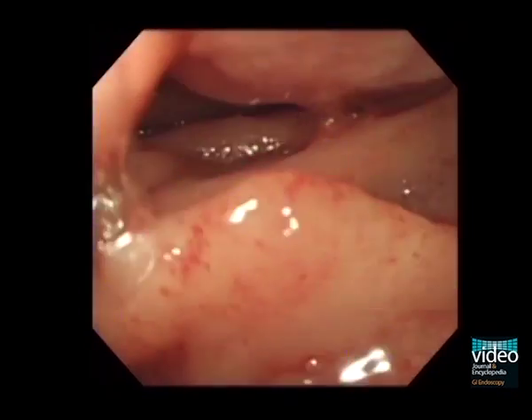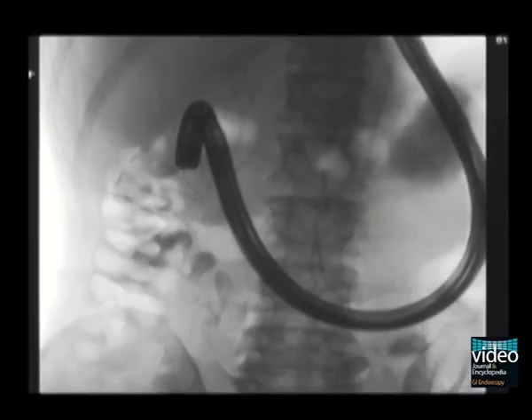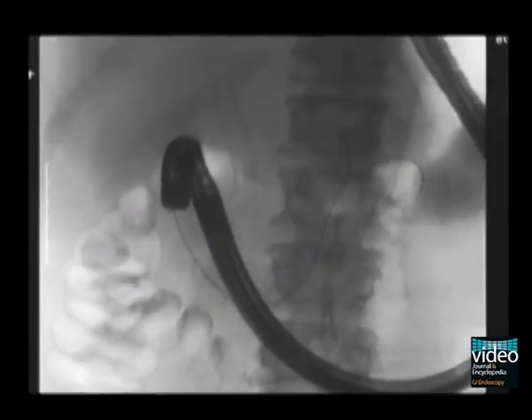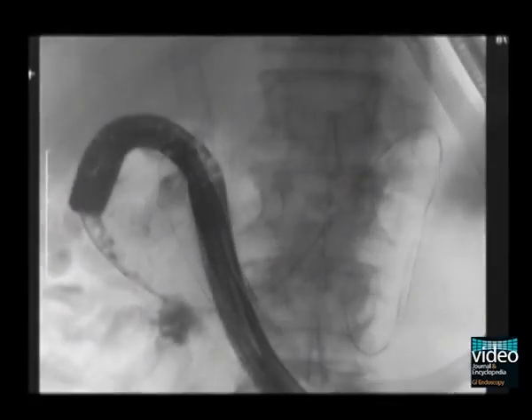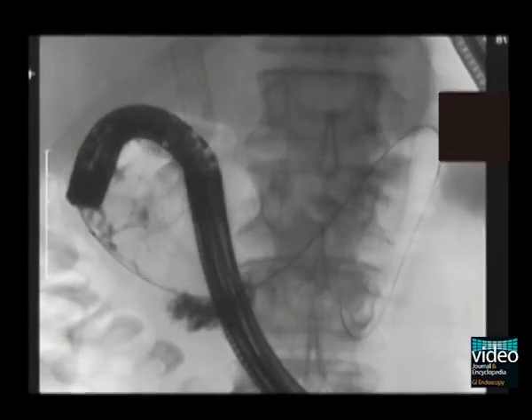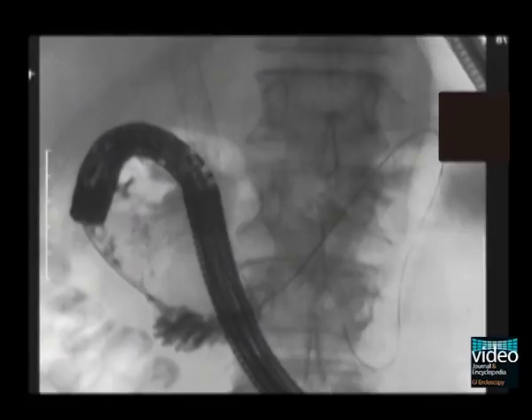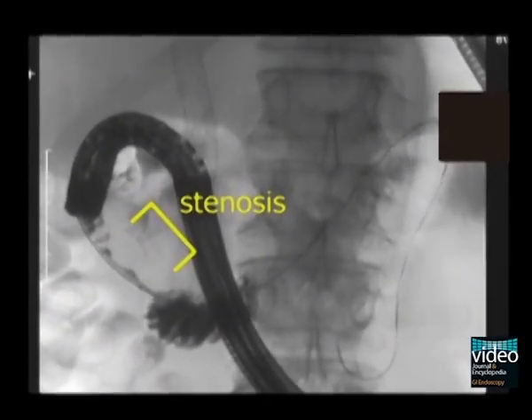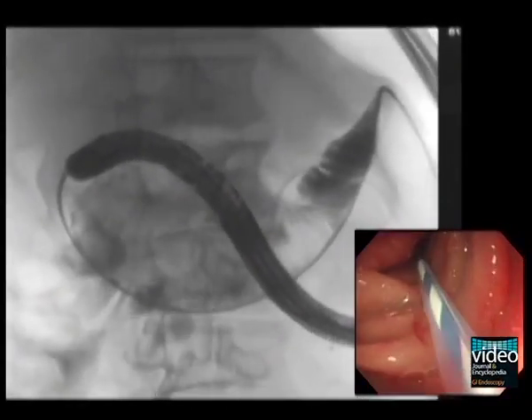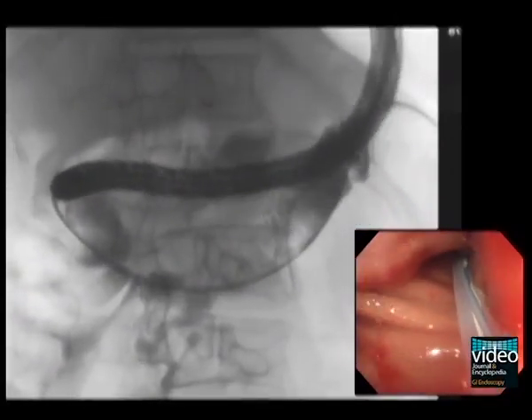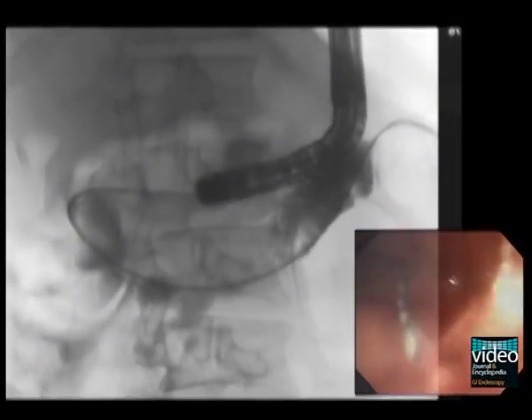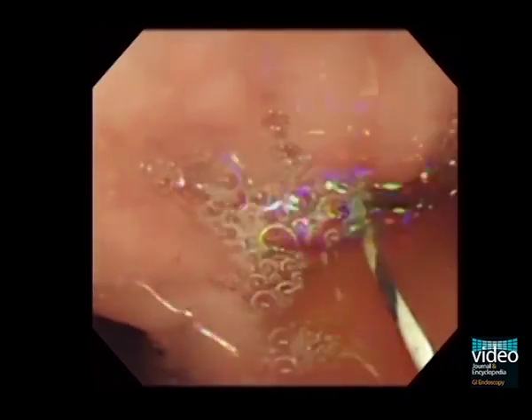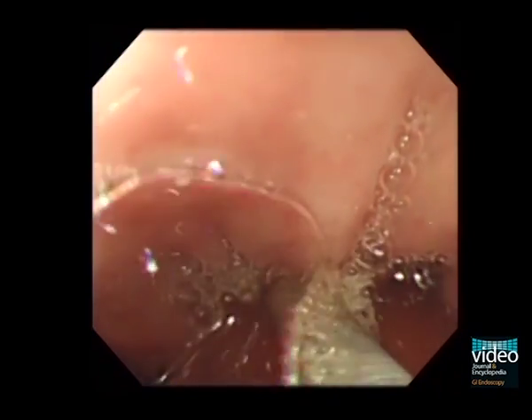Here you see the stenotic part of the duodenum. In this case, a guide wire is introduced with the aid of an ERCP catheter. Contrast medium is then injected via the ERCP catheter. Sufficient injection is important to define the length of the stenosis. The endoscope is withdrawn to the stomach. The delivery system is then introduced through the stricture.